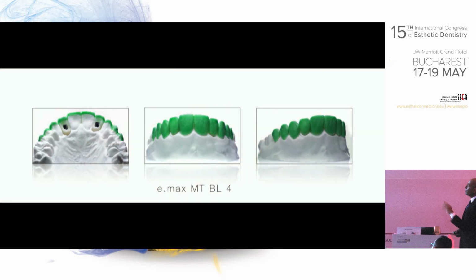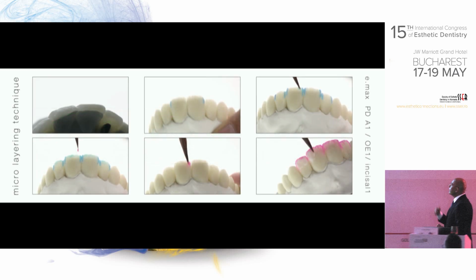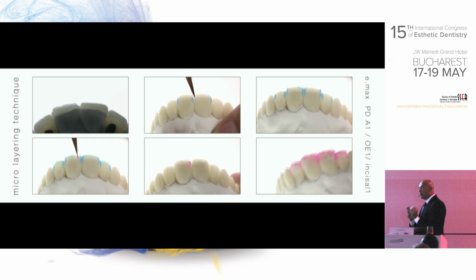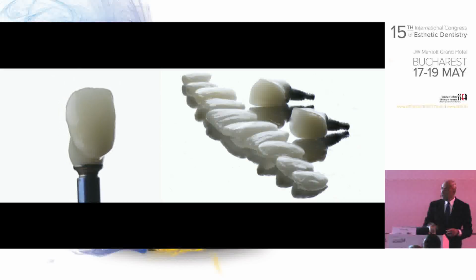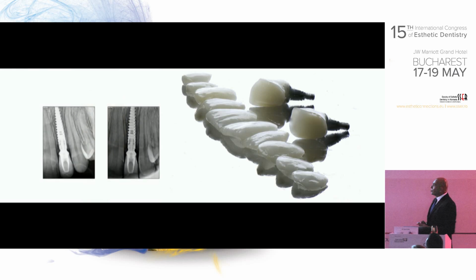And on top of this impression, now Hilal is doing the wax-up. And then finally, this is the micro layering technique, which he does amazingly. Small cutbacks, small additions, and it makes it look extremely real. And these are the veneers, and this is the prepped abutment like a veneer. So this is the X-ray we see after we screw the abutment in, and look how precisely it fits there.